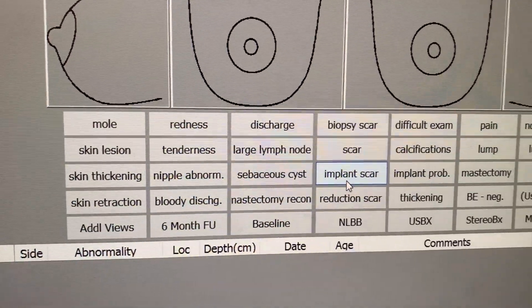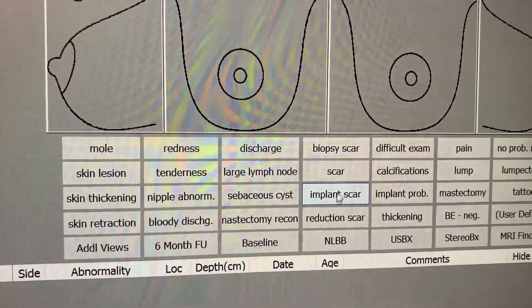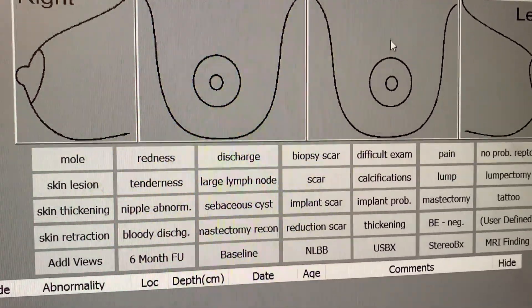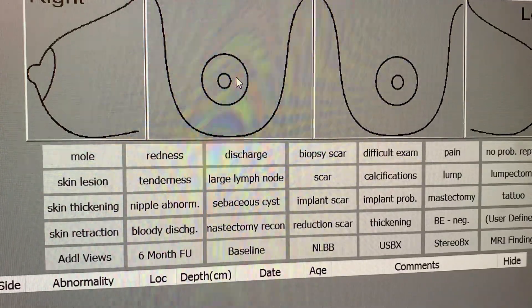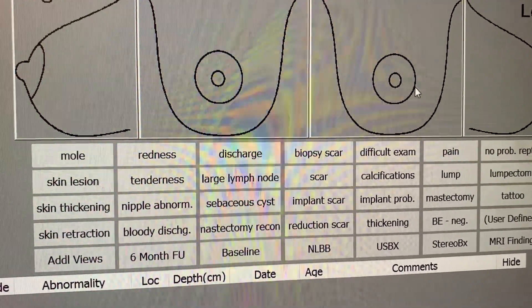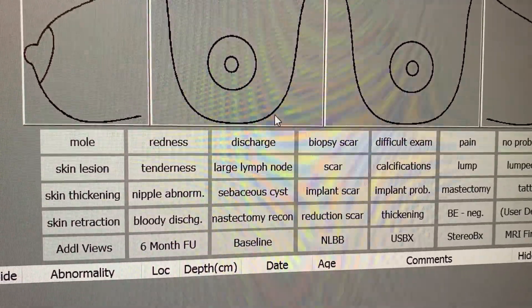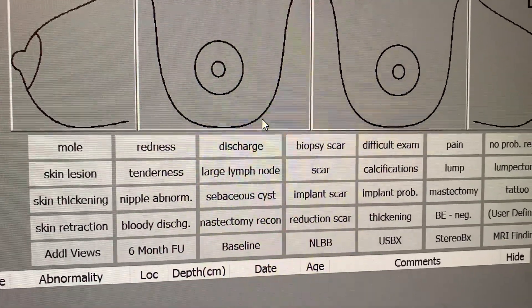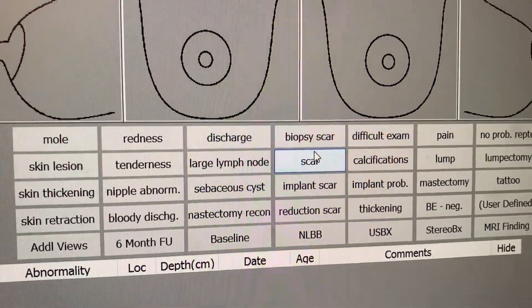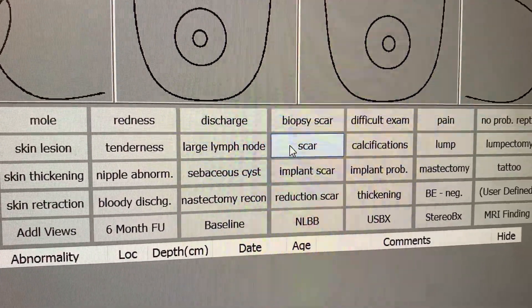When a patient comes in for a diagnostic mammogram, there are certain things we have to select. If they come in for a lump, you mark it on this diagram showing where the patient has the lump. This also applies for pain — you mark where the patient is stating they have pain. You also put in the time frame the patient says they've been having the pain or lump, and make sure to put it in the notes.